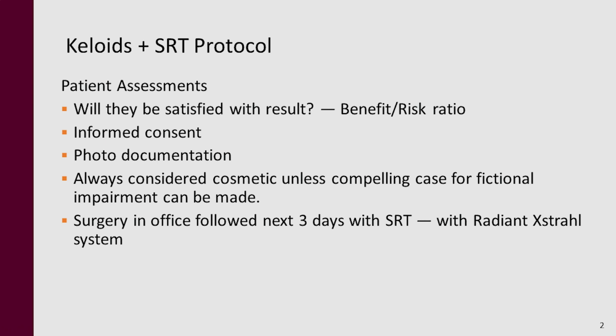I do a lot of surgery in my practice. So the first part of it, of course, is the surgical aspect, to be able to excise a keloid and close it. And usually it's in a challenging area like an ear. That's the typical spot. Sometimes I have to kind of rebuild these things. So a lot of what shows is the combination of my interest in doing that kind of surgery, and then having the ability to use the Xstrahl device to follow up with radiation. Let me start with my first slide with keloids and protocol.